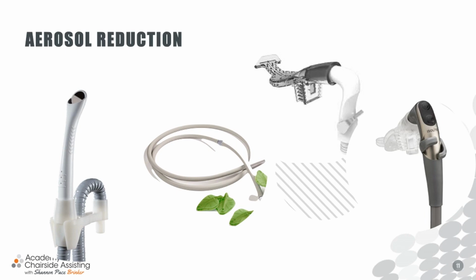One of the things I want to make sure of is that you're using one, because you can't do any quality dentistry without some type of isolation. And if you're not, it won't last. We know that. One of the things that we see a lot is when we're not using isolation and we wish we would have: brackets that debond for orthodontics, bonding crowns and composites, cements, things like that.